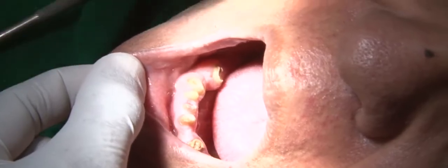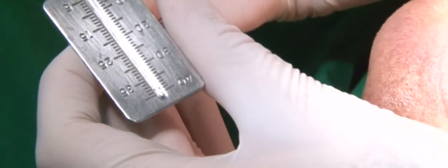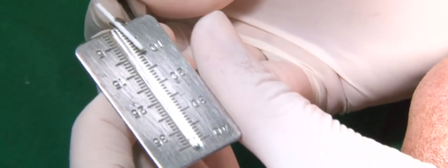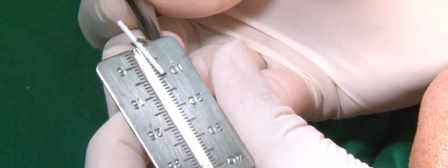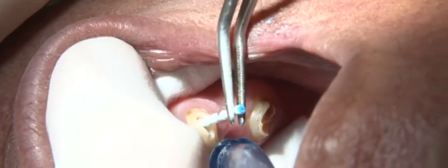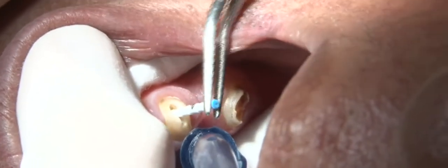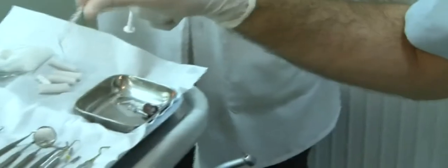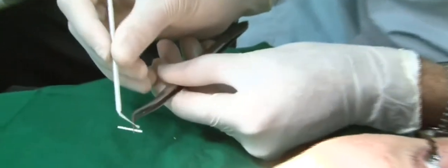Once the size of the post is selected, we will adjust the length of the post. There should be at least 2 to 3 millimeters of post present in the coronal part of the tooth to provide adequate support to the core structure of the tooth. The required length is marked on the post with a marker and the post is reduced to the given length using an aerotor. Once the length of the post is adjusted, it is dried with the help of cotton or gauze and a layer of silane is applied on it. This helps in better bonding of the post to the cement.